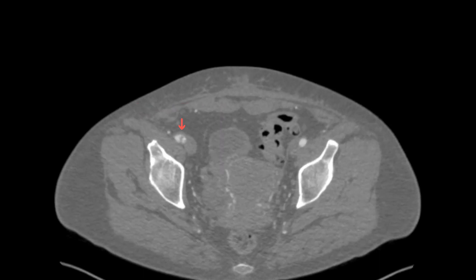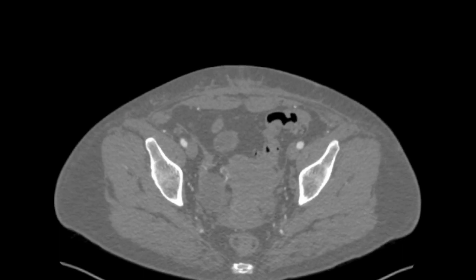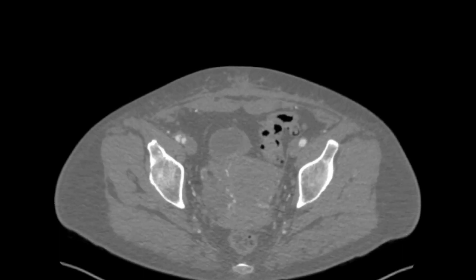The decision was made to take the patient to the operating room for an abdominal aortogram, pelvic angiogram, and a right lower extremity angiogram.